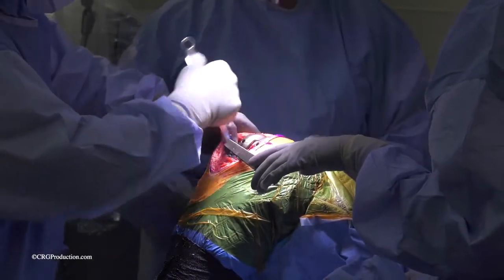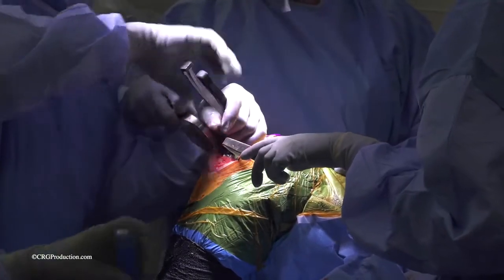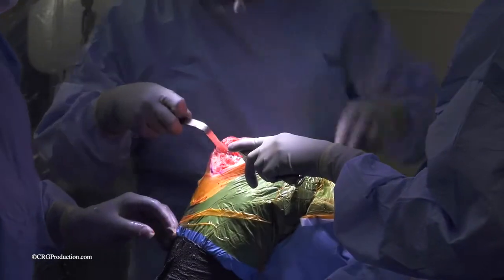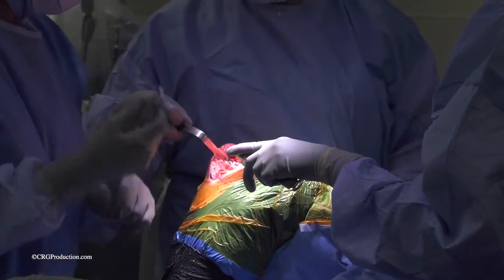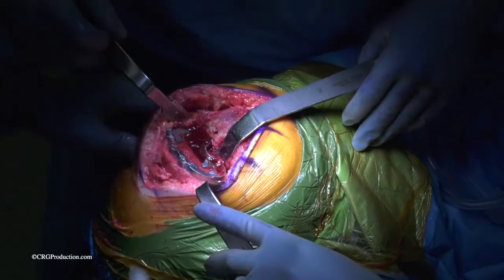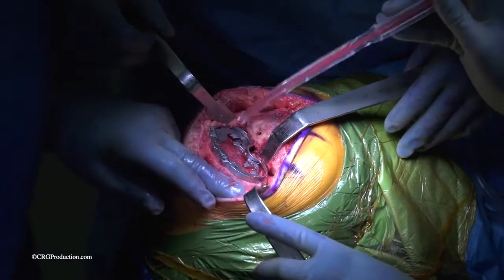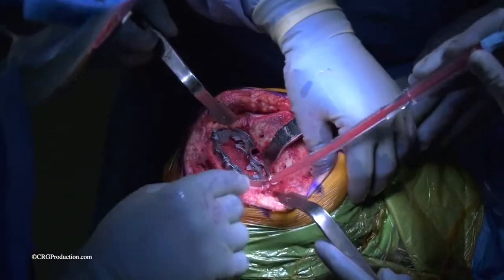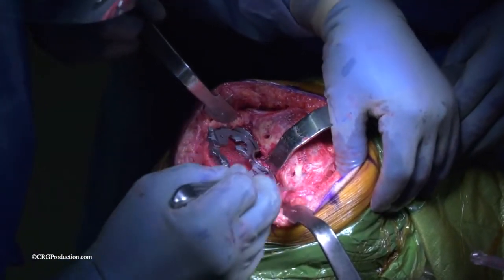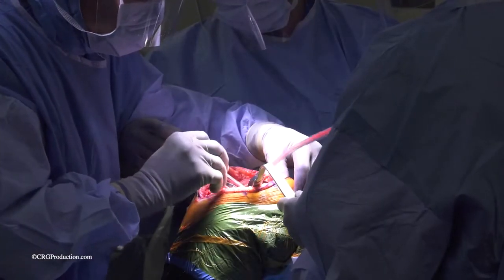Now what we have to do is remove the femoral trial, and on the tibia component there is a keel, it's called, and we have to punch out the keel. The tower will be inserted next. Make sure that the tibial trial is perfectly on the top of the tibia. Small cyst is noted.